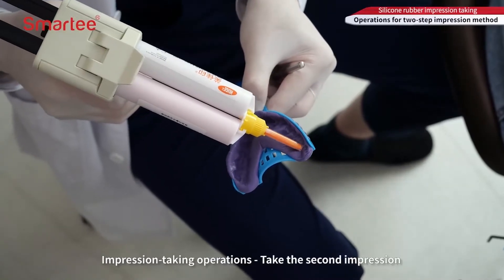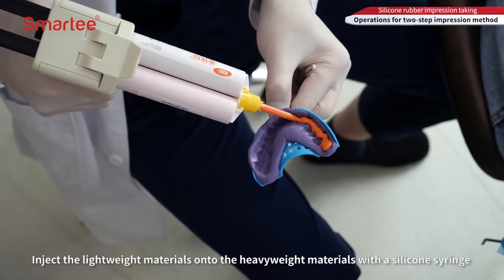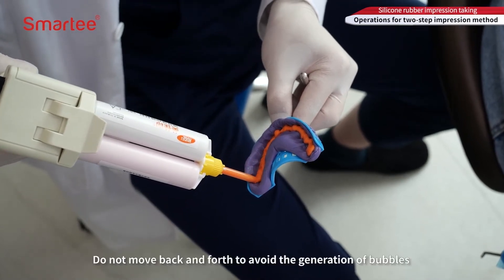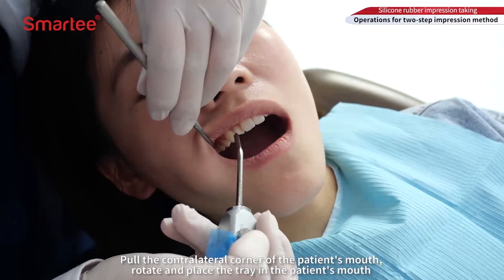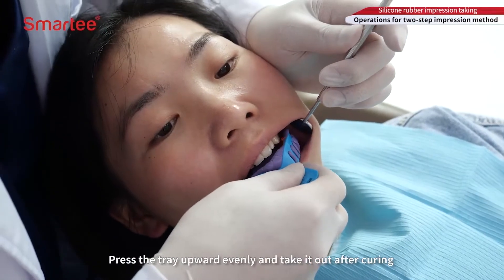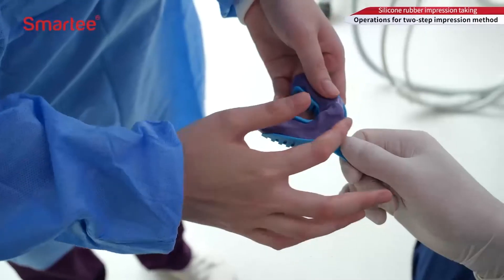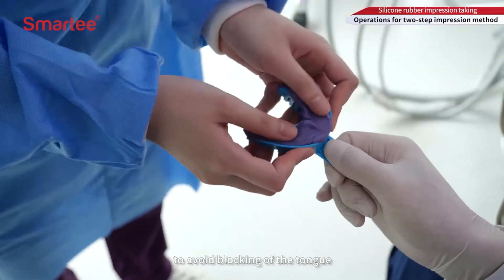Take the second impression: inject the lightweight materials onto the heavyweight materials with a silicone syringe, evenly along the heavyweight impression dentition with the injection head. Do not move back and forth to avoid generating bubbles. Pull the contralateral corner of the patient's mouth, rotate, and place the tray in the patient's mouth. Press the tray upward evenly and take it out after curing. Check whether the gingival margin is clear without obvious bubbles and delamination and with intact dentition. When taking the mandibular impression, the separation film should be cut from the lingual side to avoid blocking of the tongue.